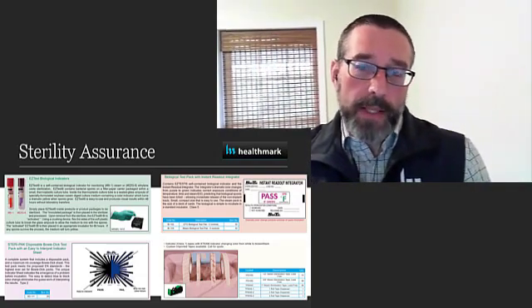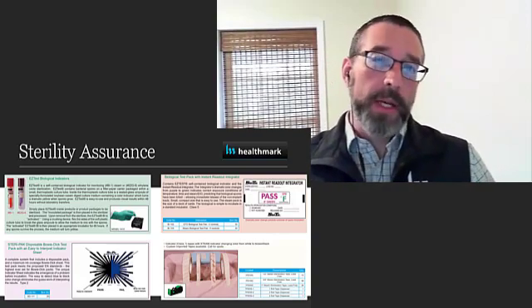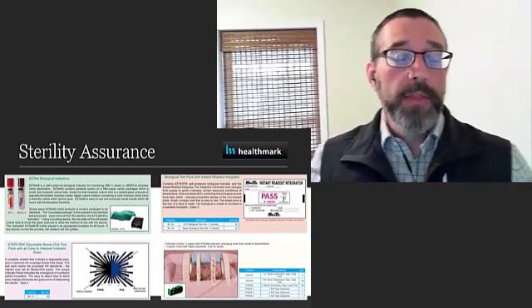Here's going to be the biggest thing for you. We say this all the time, and it's absolutely true. If you didn't document it, then it isn't done.